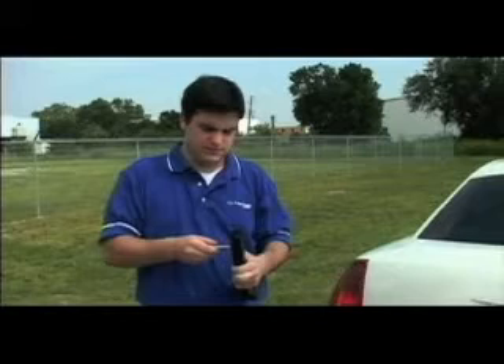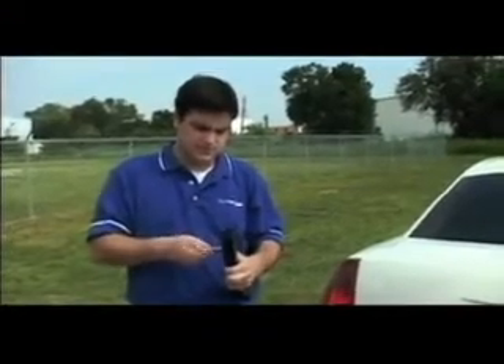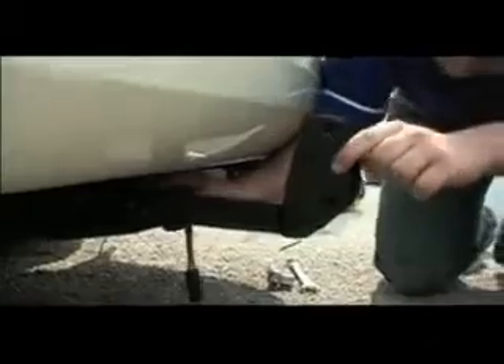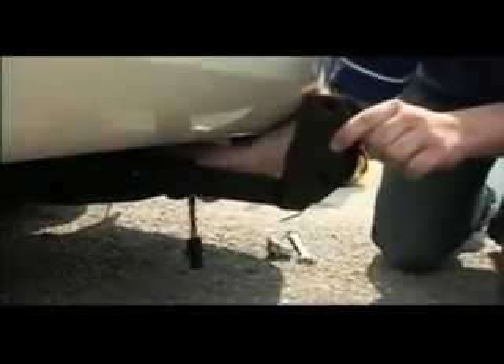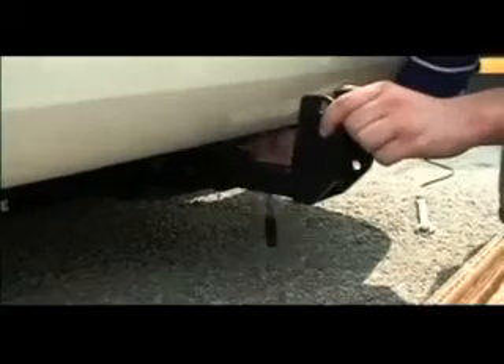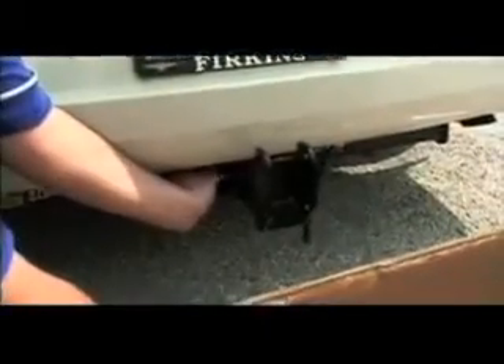Locate the hitch adapter inside the box. This video shows a class 2 hitch adapter with a single threaded hole. Your hitch adapter may vary depending on the application. Remove the bolt from the hitch adapter and slide the adapter into the vehicle's hitch receiver. The hitch adapter may be positioned pointing up or down depending on the distance from the bottom of the hitch receiver to the ground. For proper lift operation, it is important to ensure that the vehicle hitch is level to the ground. Tighten the bolt and add a locking nut to secure.